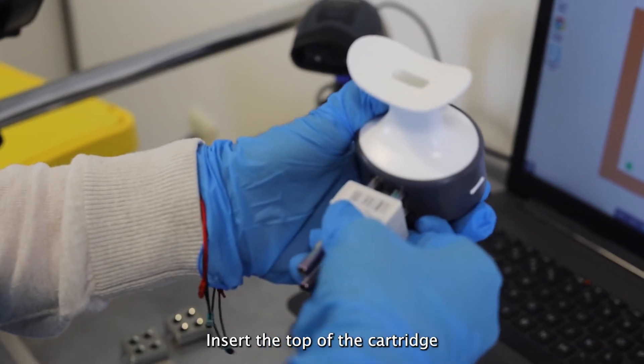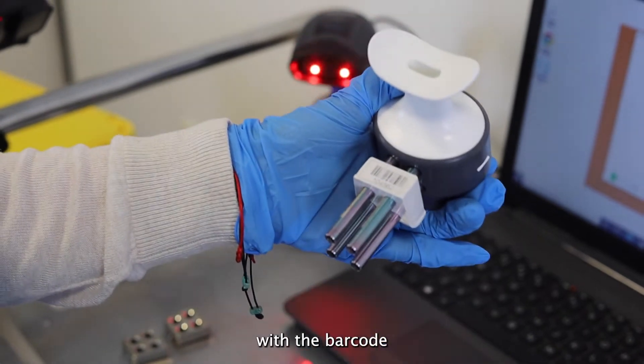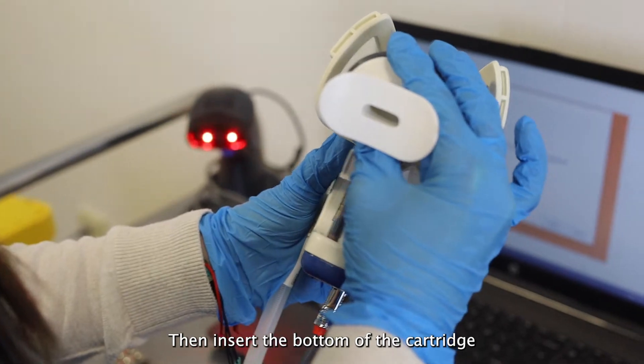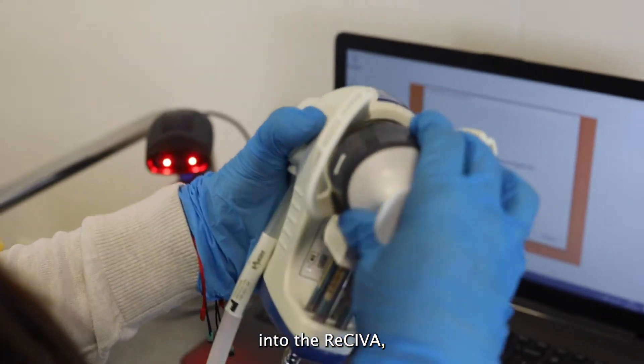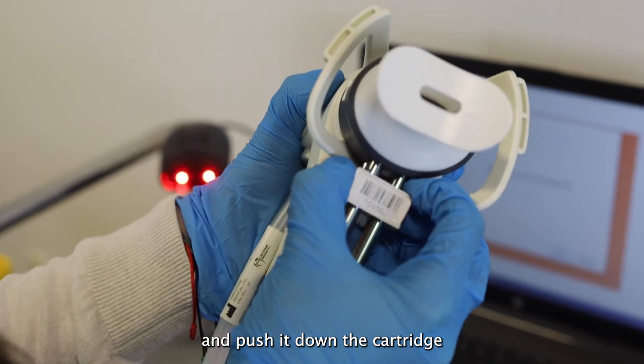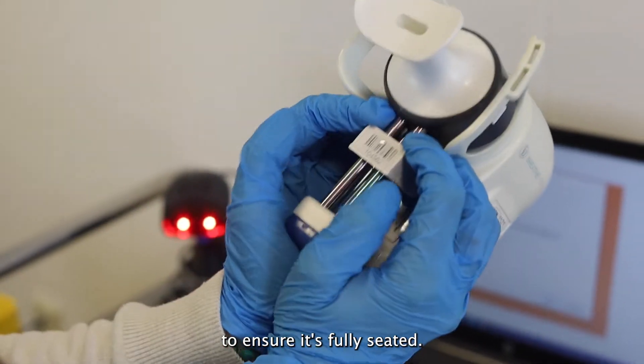Insert the top of the cartridge into the mouthpiece with the barcode facing out towards you and upright. Then insert the bottom of the cartridge into the receiver. Push the mouthpiece back into the housing and push down the cartridge as far as possible to ensure it's fully seated.